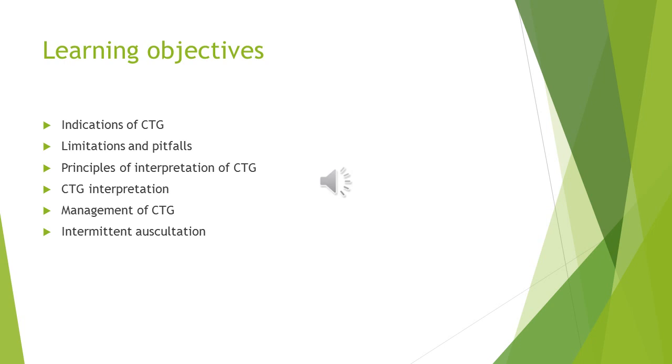Our learning objectives would be to know the indications of CTG, limitations and pitfalls, principles of interpretation, CTG interpretation, management of different patterns of CTG, and the value of intermittent auscultation.